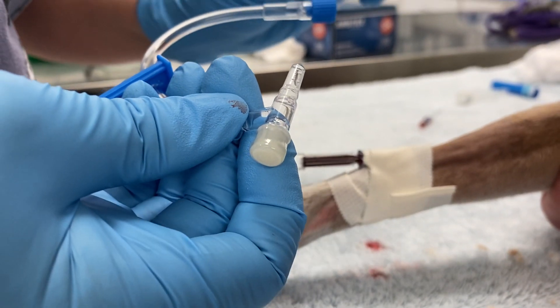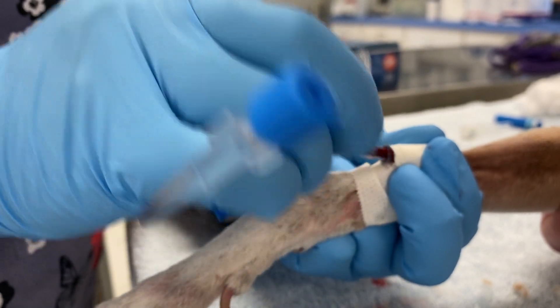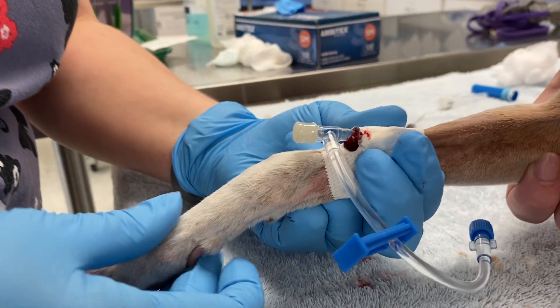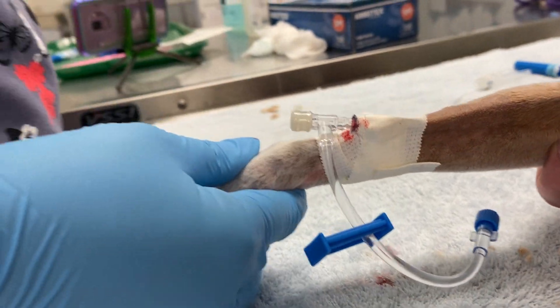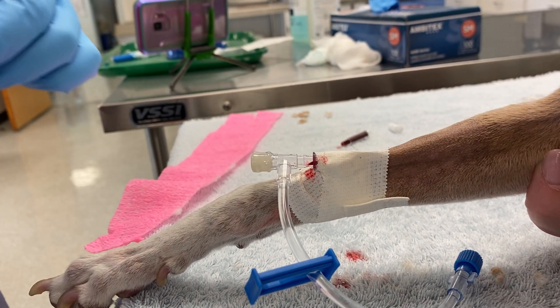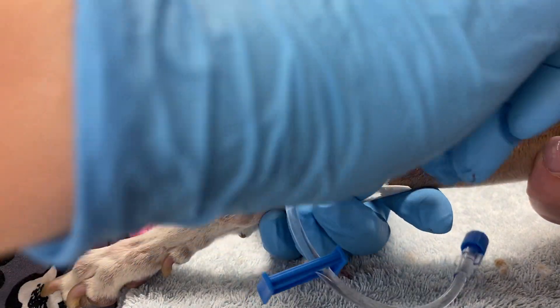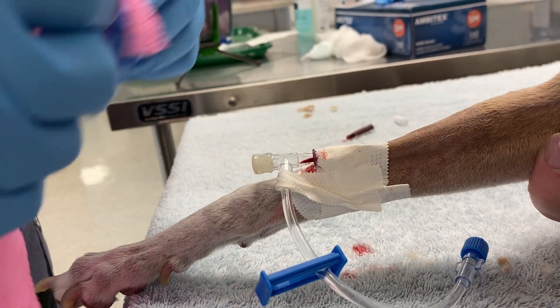I'm going to use a T-port — you can use an injection cap or a short extension set. Make sure you don't touch the end of that as you disconnect, put it on there, and make sure it's secure. Use your gauze to dab it and make it nice and clean. If this is really, really loose — this part isn't necessary for class — but if you notice that it seems really loose and you don't trust your tape, there is a little stirrup that you can put here. But that is a skippable step.